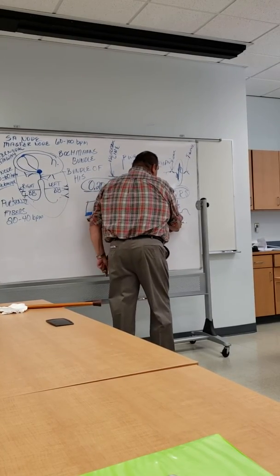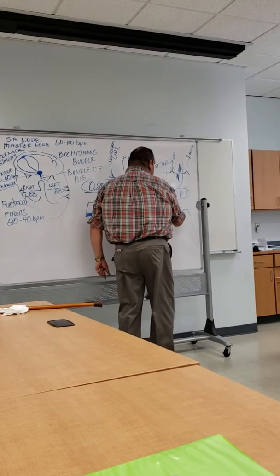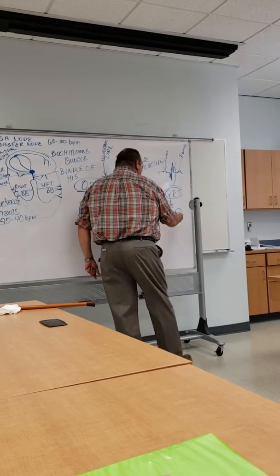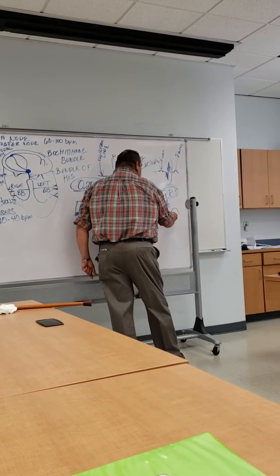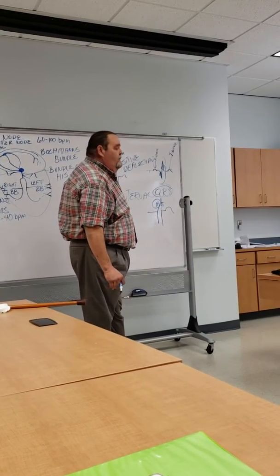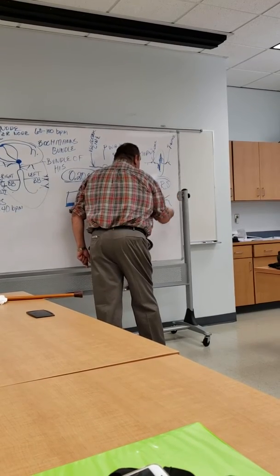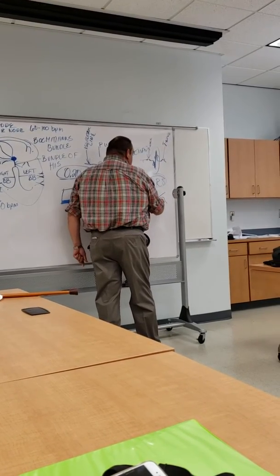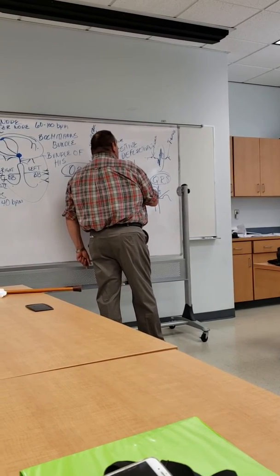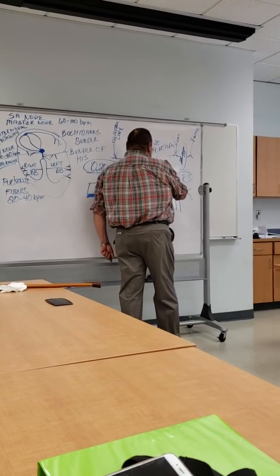All right, from the beginning of this QRS to where it comes back and makes its final turn on the isoelectric line. This notch where it makes its turn on the isoelectric line is where I'm looking. Right there you need it to be.